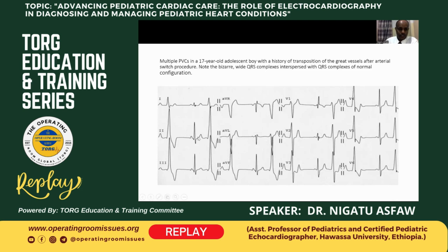And this is an ECG paper which shows premature ventricular contraction waves, which are interspaced with normal QRS complexes.